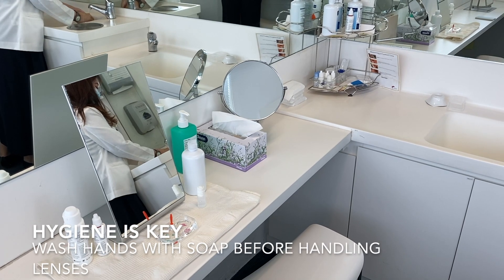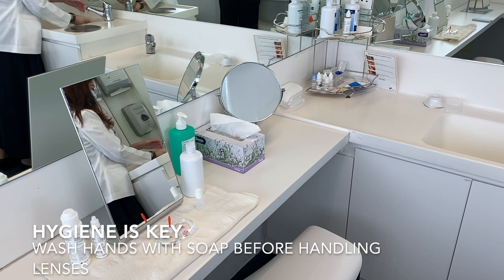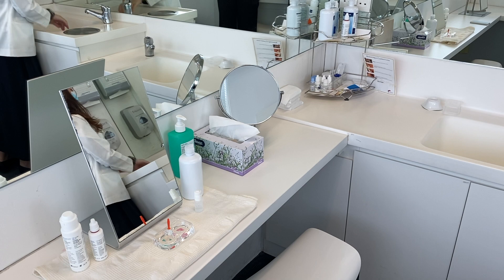First of all, before touching any form of contact lens, we must wash our hands diligently. We do not want to transfer the germs from our hands onto the contact lens surface.